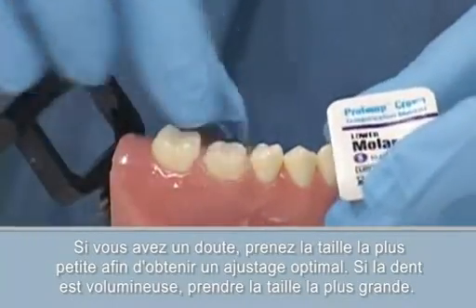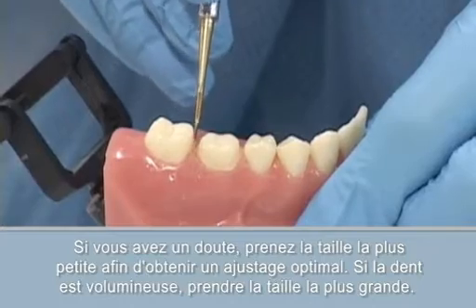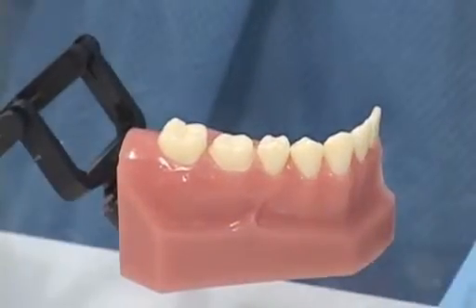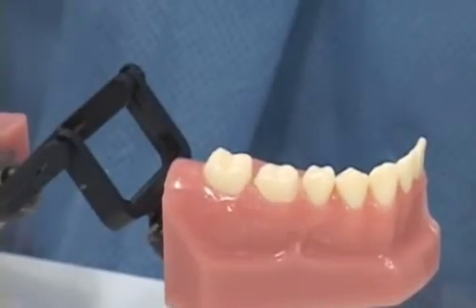So again, we're going to analyze the prep first, and make sure that there's no debris in approximately here. I want to make sure that I don't have any dust, or tooth dust we should say, in between before we start making our restoration here, our provisional restoration. So, got that first. The next thing I'm going to do is look at this ruler.